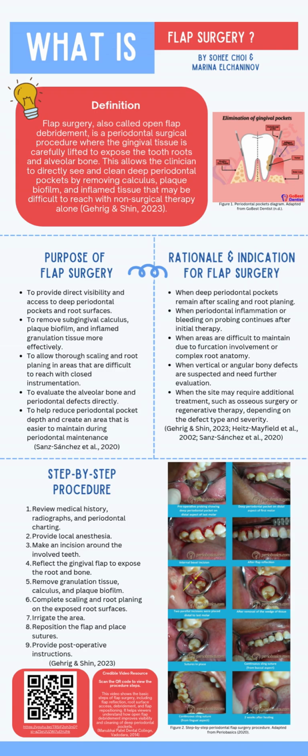Hi, I will be introducing flap surgery, also known as open flap debridement. Flap surgery is a periodontal procedure where the gingival tissue is carefully lifted to expose the tooth root and alveolar bone. This gives the clinician direct access to deep periodontal pockets that are difficult to treat with non-surgical therapy alone.